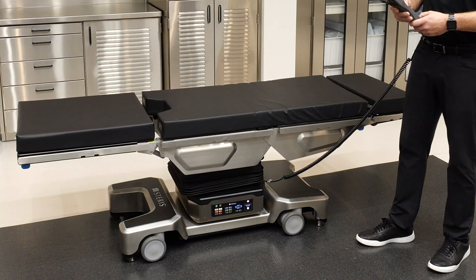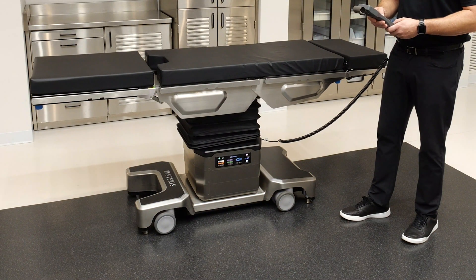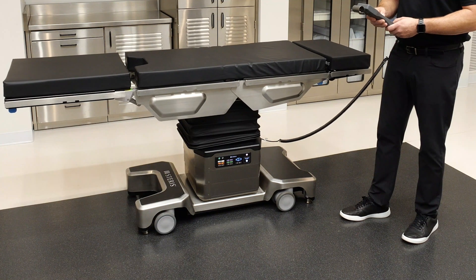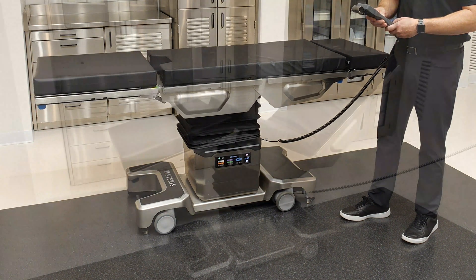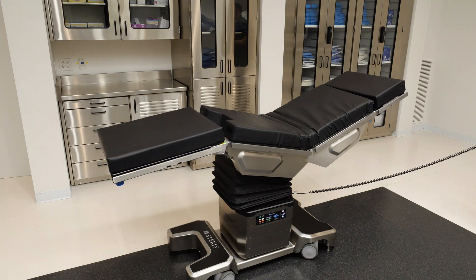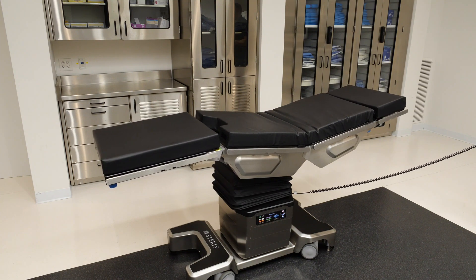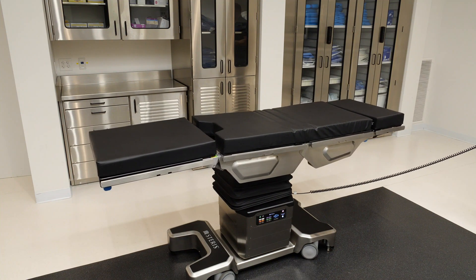With an all-electric surgical table, you get some advantages over other table types such as hydraulic tables. For instance, it will offer very precise and smooth movements while you're articulating the tabletop. You'll also get simultaneous movements of the tabletop, which means multiple sections moving at one time. This helps to get patients into position quickly, which is good for efficiency as well as getting back to level in emergency situations.